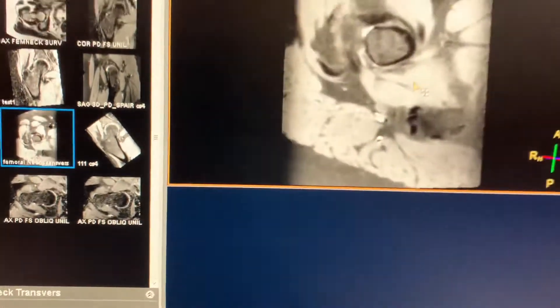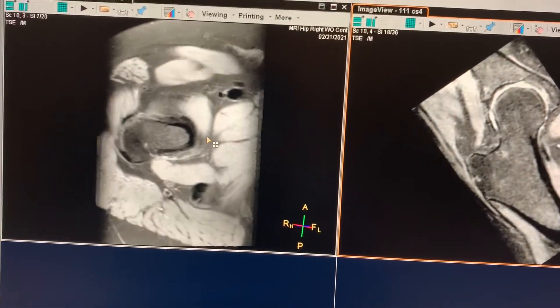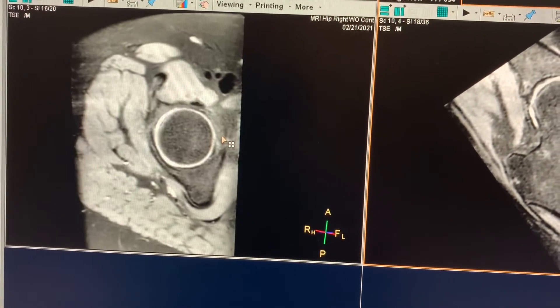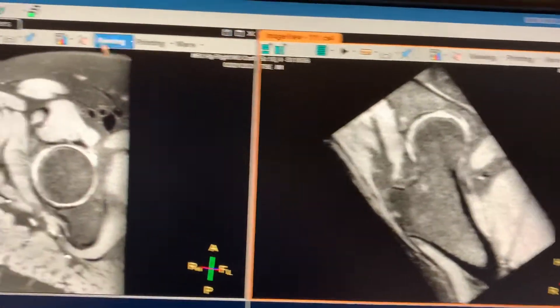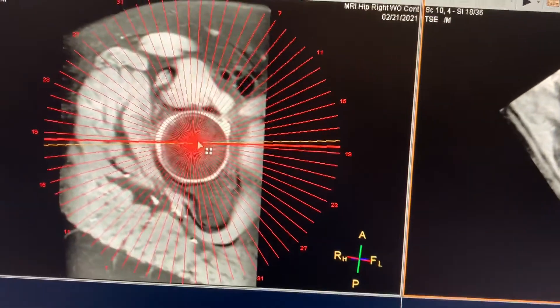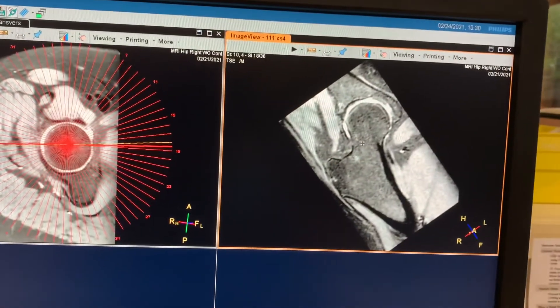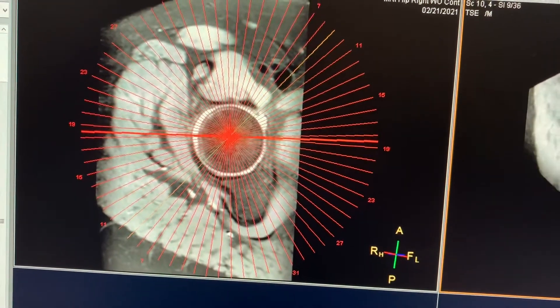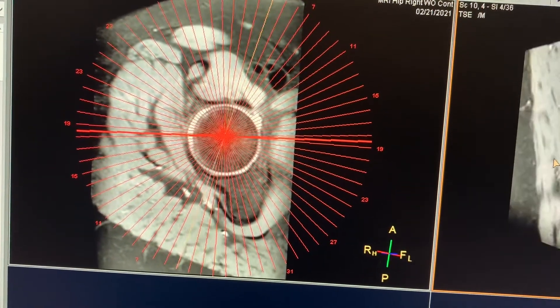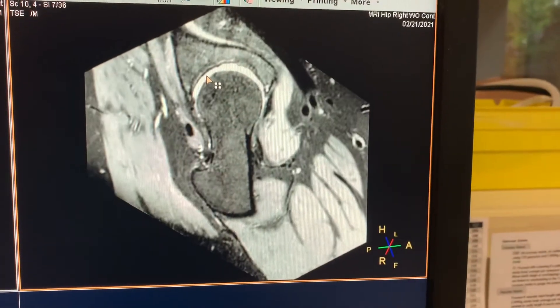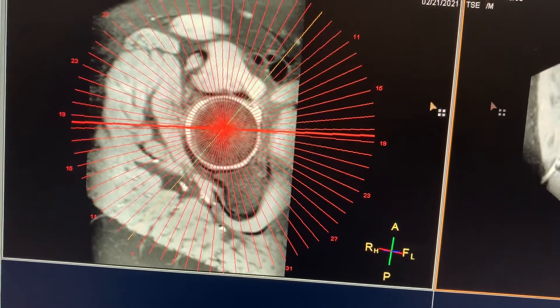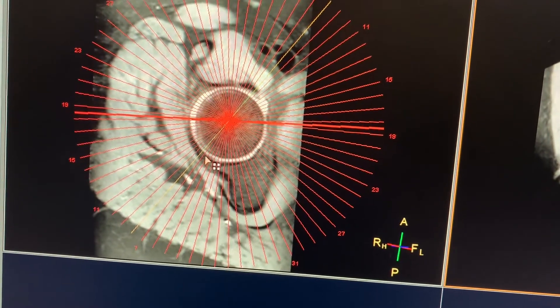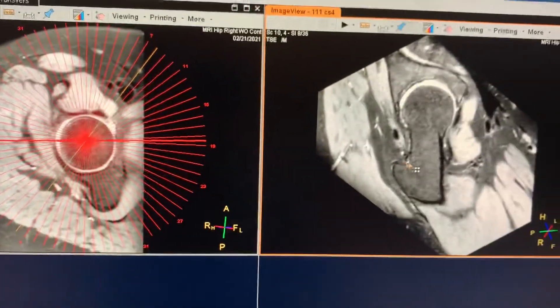I'll show you why you need both sequences and how they reference each other. Pull the femoral neck series and the reformatted 3D together. Point a reference right onto the femoral head — it should be a perfect circle. As you scroll through the images, the green reference line gives a perfect correlation. This is what the radiologist and surgeon need: if they see any obstruction, narrowing, or rupture, they can reference and mark it for surgery.